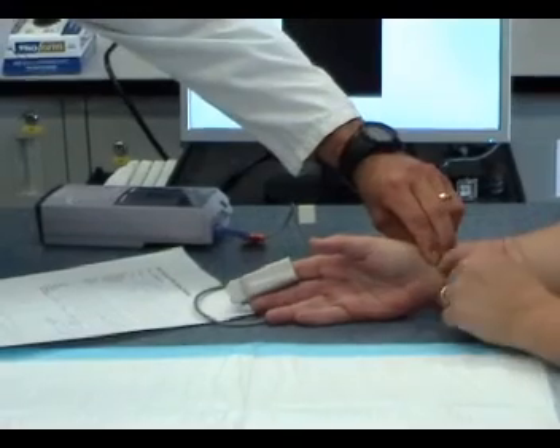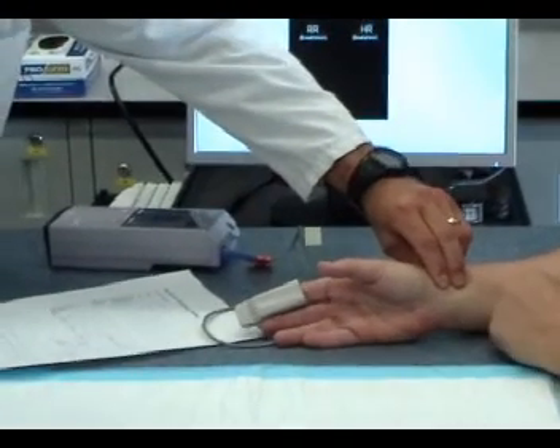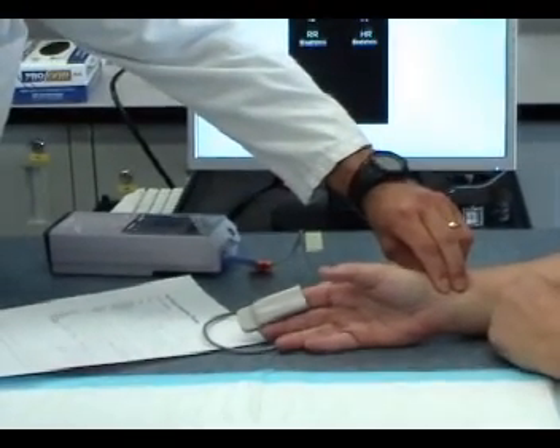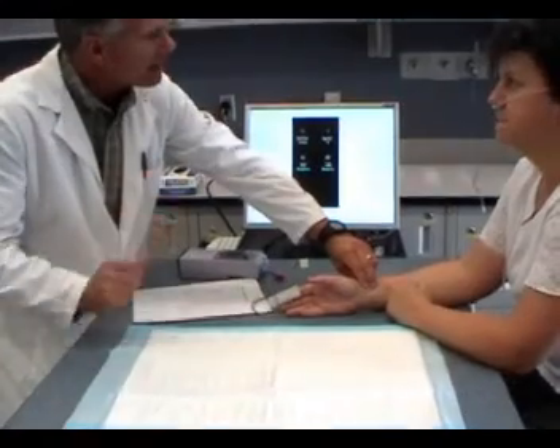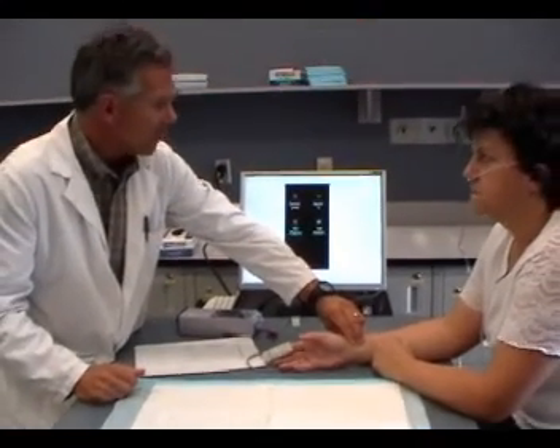Have you ever had a blood gas done before? Yeah, you've had one of those done before? Okay, do they hurt? Yeah, they do hurt a little bit. We are putting a needle in the skin, so you're going to feel some discomfort from that.